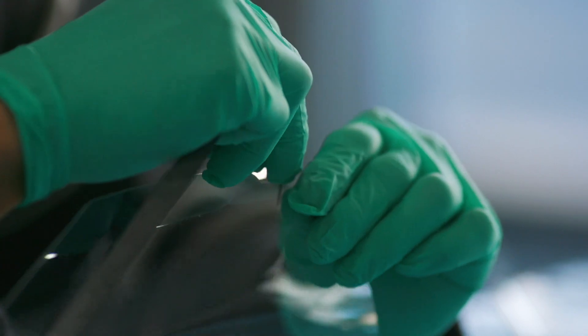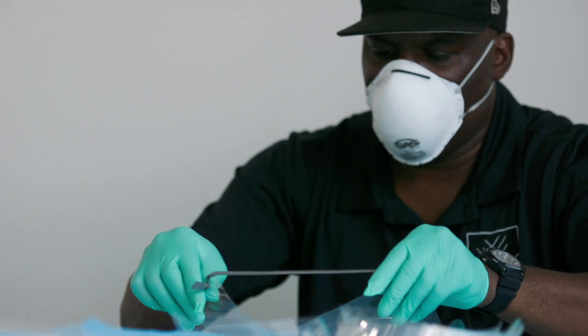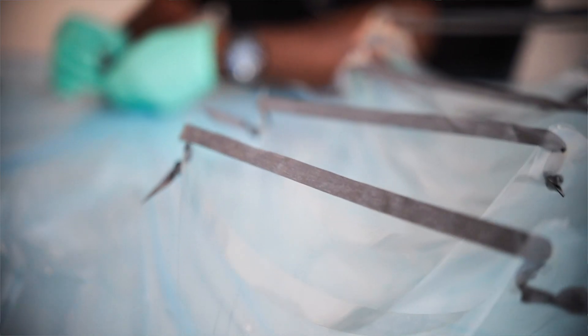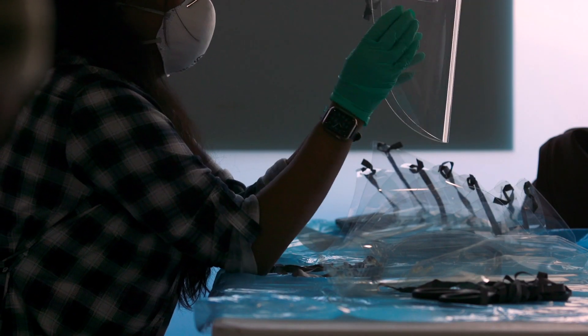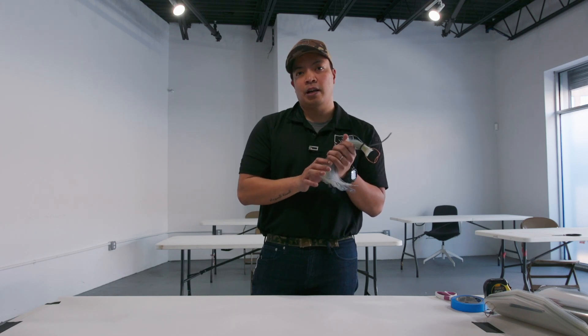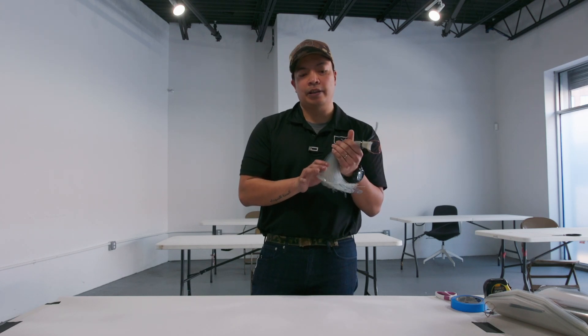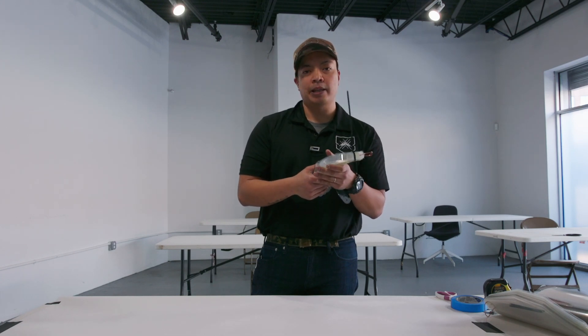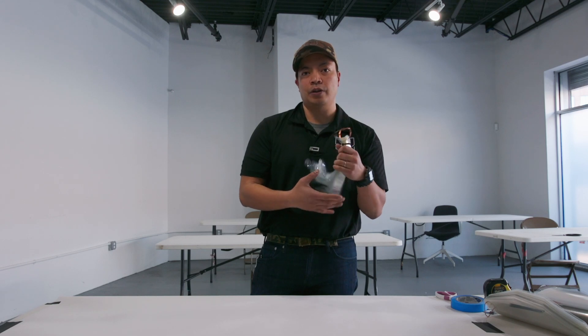My name is Joseph Zaleta. I'm with The Black Six Project and today we're going to talk about how we're going to put together these face shields. These face shields have been laser cut by a few manufacturers and they've given us the recommendations on how to put it together. We're putting these face shields together to overcome the shortage of PPE out in the healthcare fields and also in the first responder field during this pandemic dealing with the COVID virus.